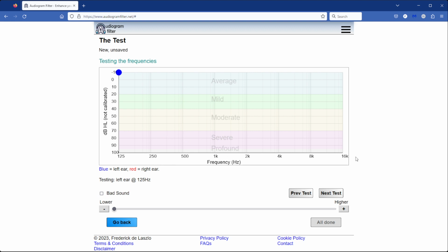Along here, you'll see the frequency. I'm using decibels hearing level, which was created by the various hearing aid companies, and all it means, if you go into the wonderful realm of psychoacoustics, it basically says that you hear different frequencies at different levels. And it looks like a curve, and by using this hearing level, we can flatten it out.